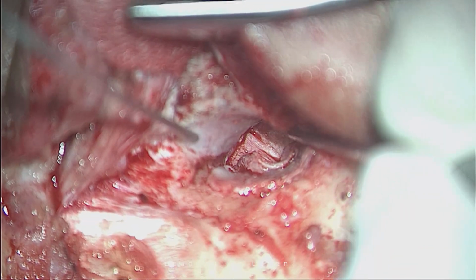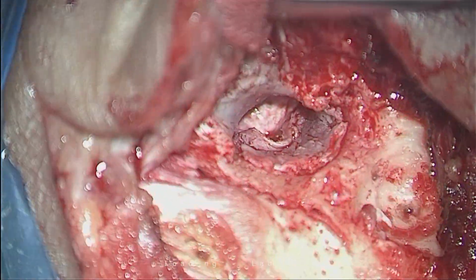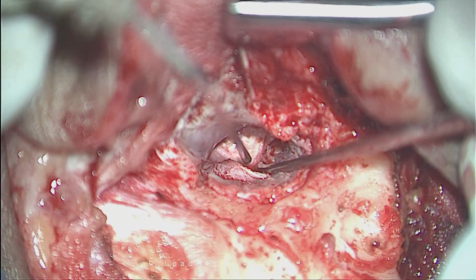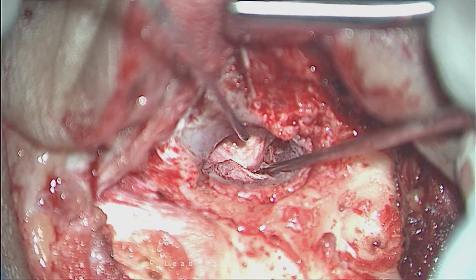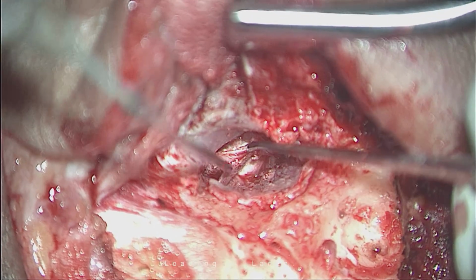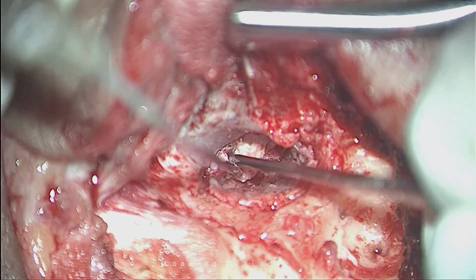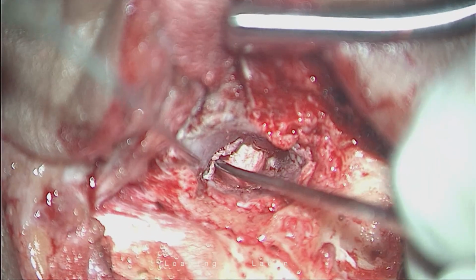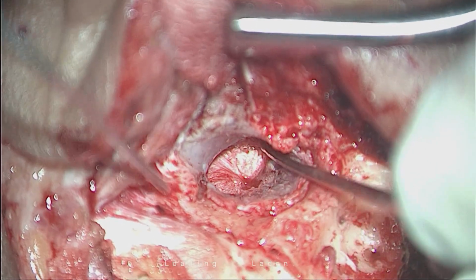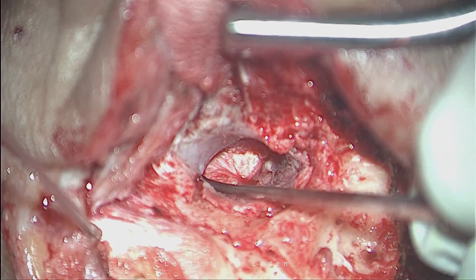See this? This is a very important part, leaving the mucosa medial to the graft, because the fundamental issue of myringitis is that it's an aseptic myringitis that occurs due to mucosal overgrowth in the classic underlay. Yes. So the way forward is to make sure that the mucosa is totally stripped from the fibrous layer and remains in the middle ear, and then you don't need to undergo total annular excision, and so forth. Yes. Now see, I am replacing the rest of the tympanomeatal flap over it.